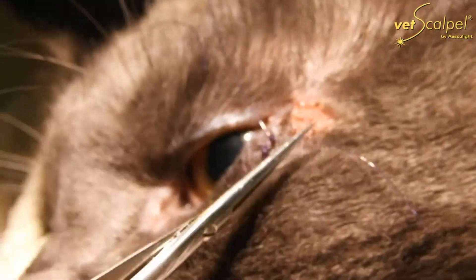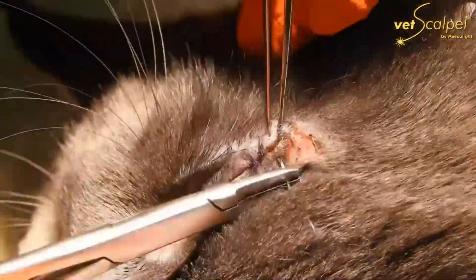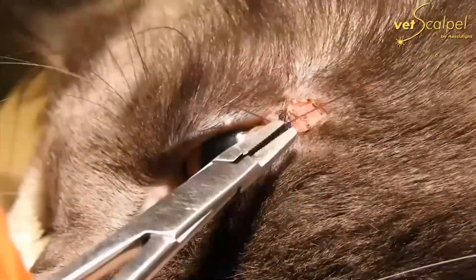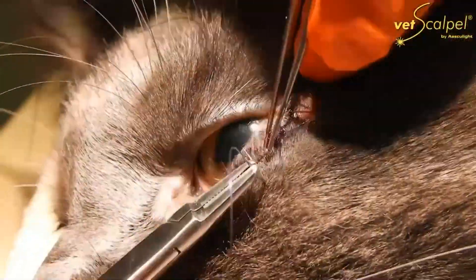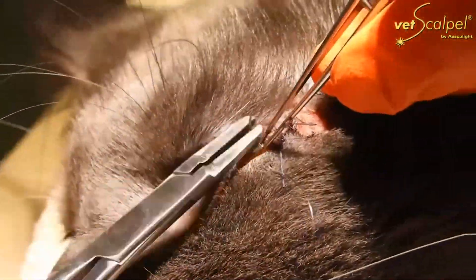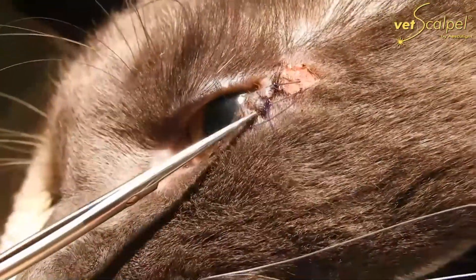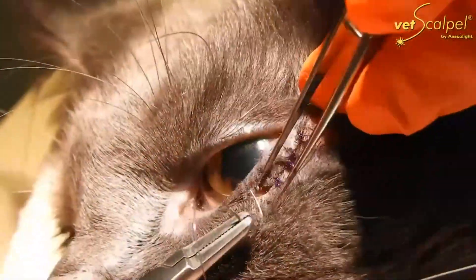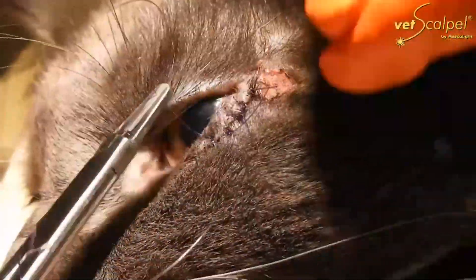Chiro was then sent home with an e-collar. He was also put on some pain meds for the first couple of days; we did not need antibiotics and did not have them treat the abrasion. When cutting the sutures, the short end of the suture is towards the eye and the long end is away from the eye to make removal easier. If you do four throws on the sutures, you'll always have one throw aimed away from the eye.